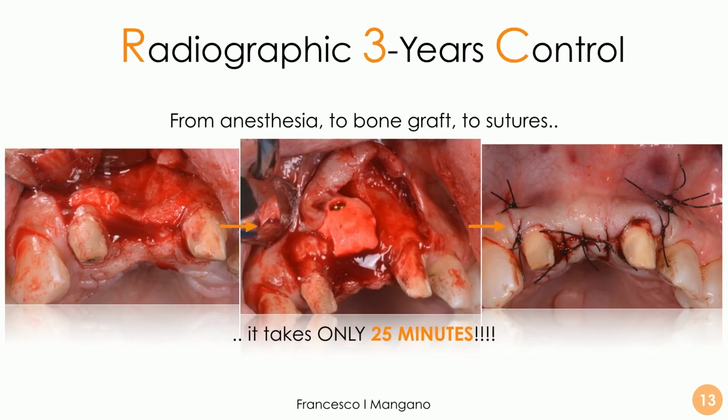What I want to stress here is that from the anesthesia to the bone graft to suture, it took only 25 minutes to make this surgery. So it is very fast, it is very simple, it is very straightforward, it takes very little. There's a perfect adaptation, so best adaptation, best result for the surgery, because we don't have any risk of failure because of lack of adaptation, movement. We can fixate the scaffold very well.